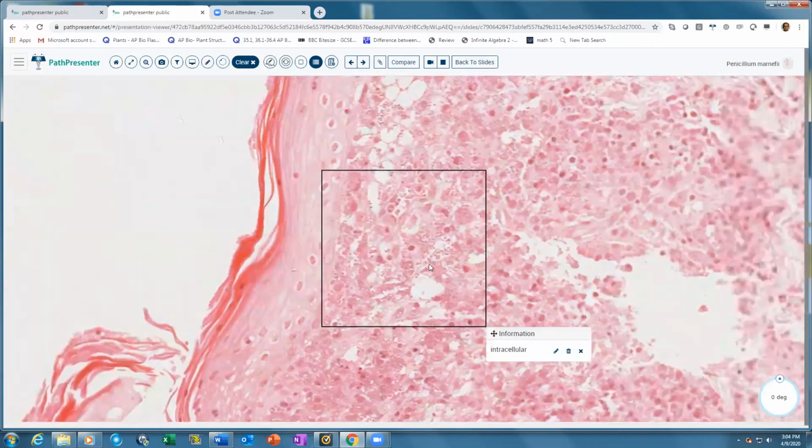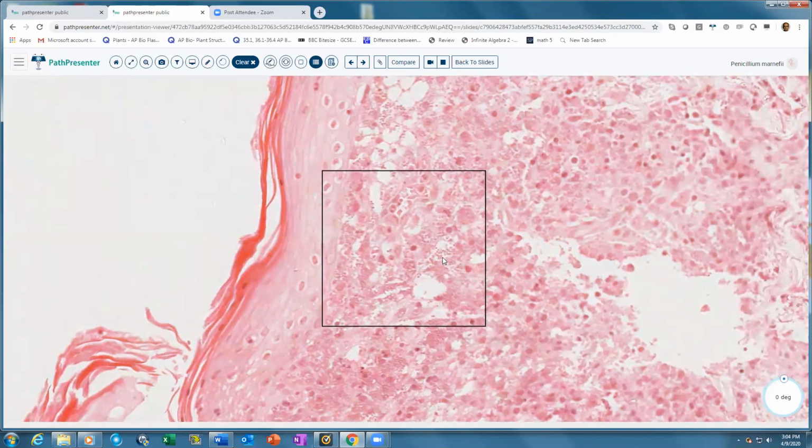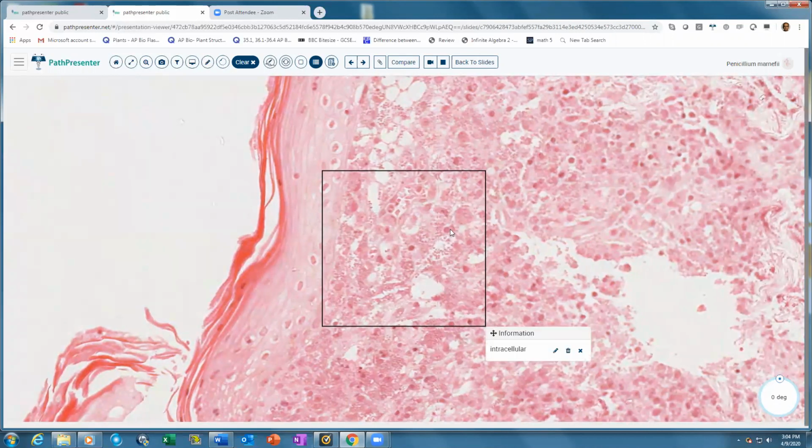And when you go high power, you will see these organisms here. This slide is a little bit faded, but this was the only example that I had. And you can see all these intracellular organisms here basically, quite a few within the cells actually. So these are intracellular yeast. They're usually 3 to 8 microns. Some are elongated. You can see some of them are elongated.